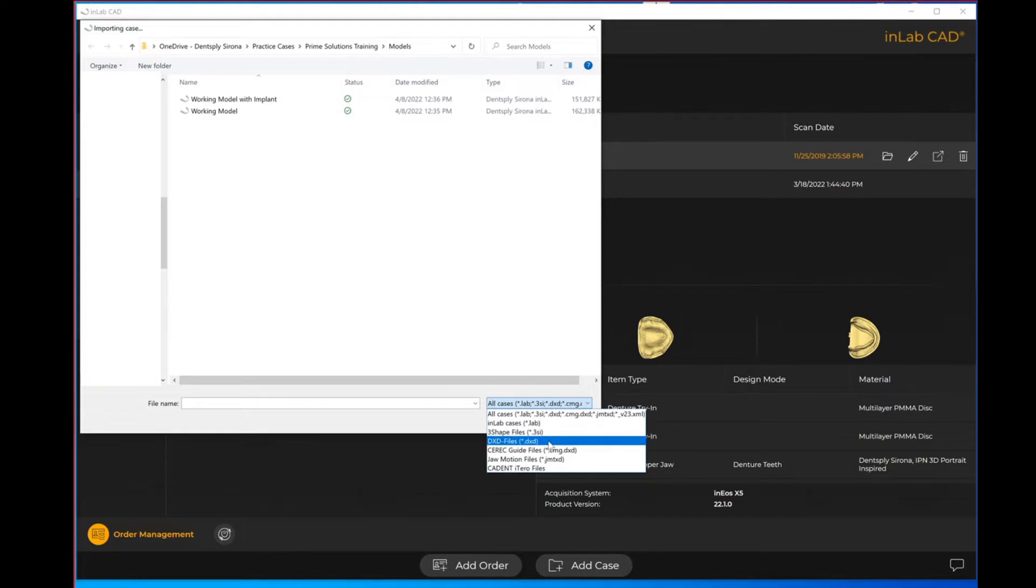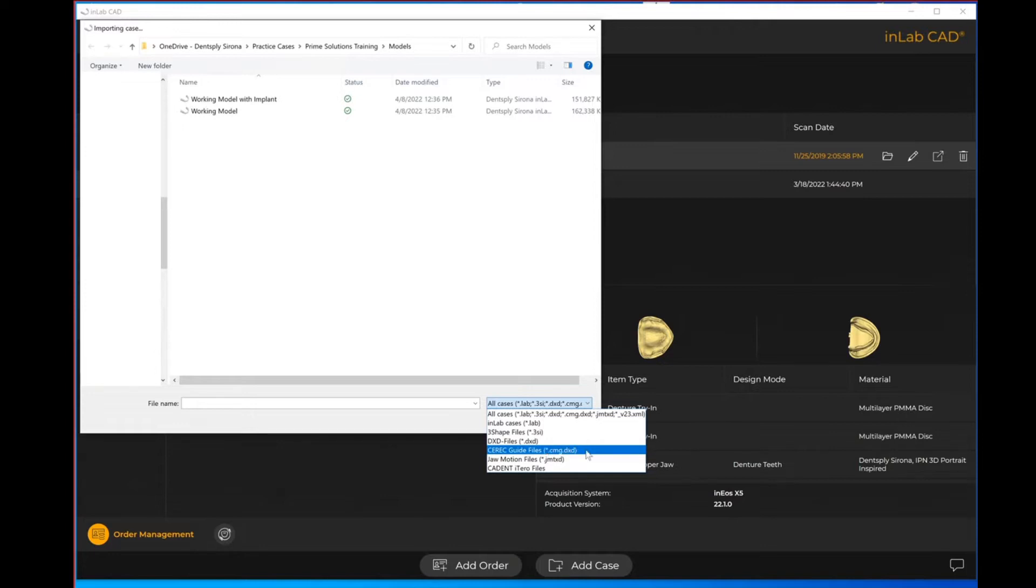You can also do a CEREC DXD file or a CMG.DXD, so that is the CEREC guide file type that you get within software like Galileos or Sidexis, so you're able to receive that file for importing to design your CEREC guides.